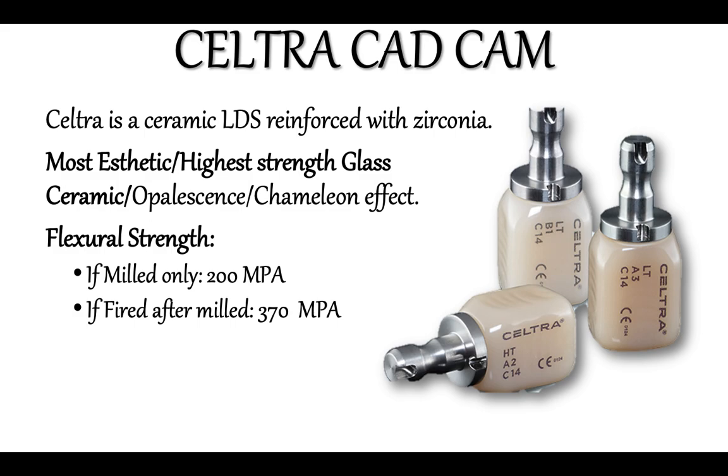They apparently have opalescence and fluorescence characteristics and what is known as the chameleon effect, so they say it's very difficult to see where the inlay or onlay margin is with respect to the tooth structure. They have a very good flexural strength.